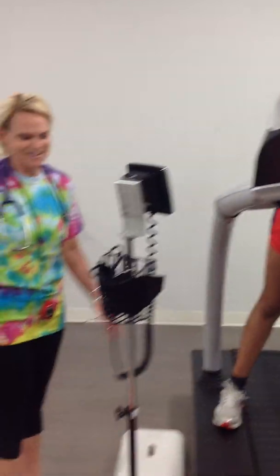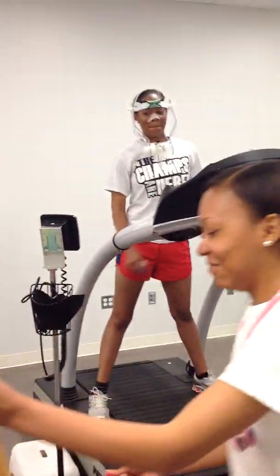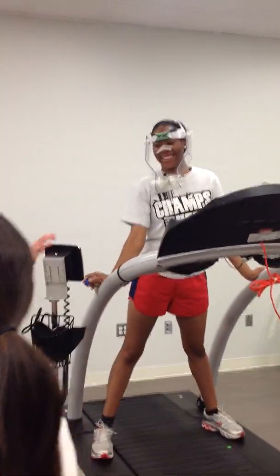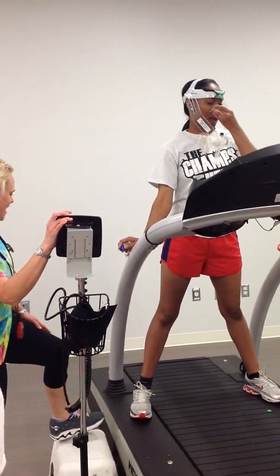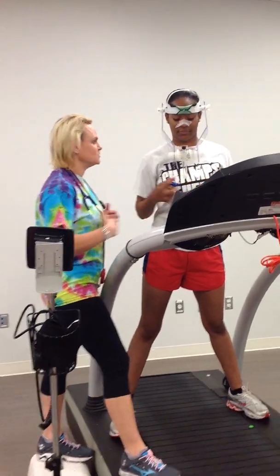Do you have any questions about this test before we get started? No. So what we're going to do is go ahead and get this mouthpiece put back onto you. We've got a nose cup — go ahead and put that nose cup all the way on.